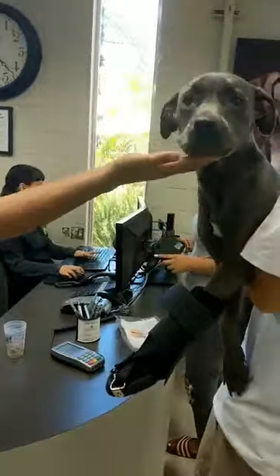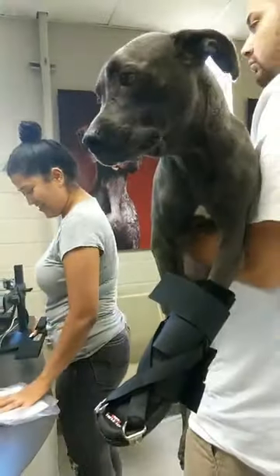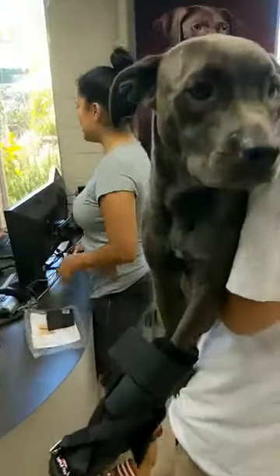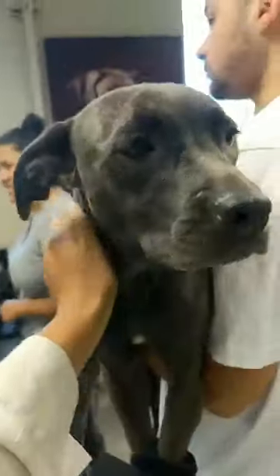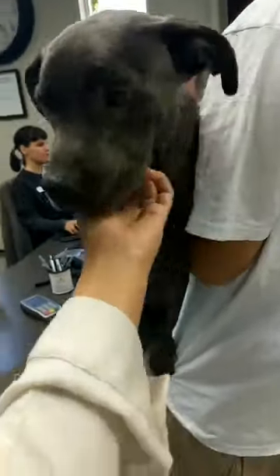Oh, you're so cute — such a precious puppy. Good job, Papa! Glad it fits better. Now you're gonna run around everywhere.